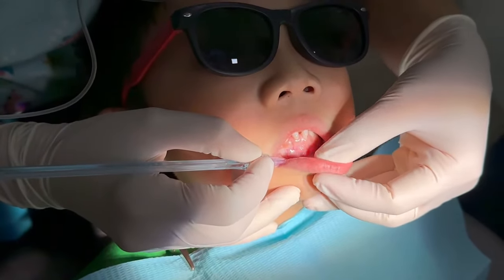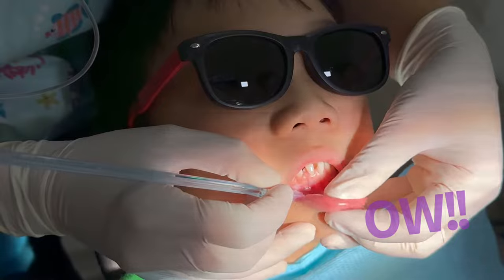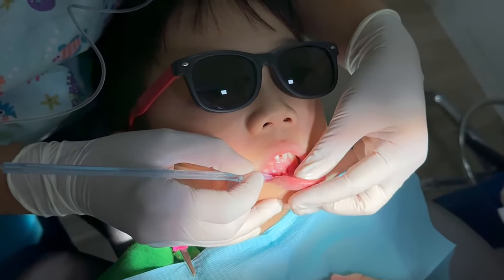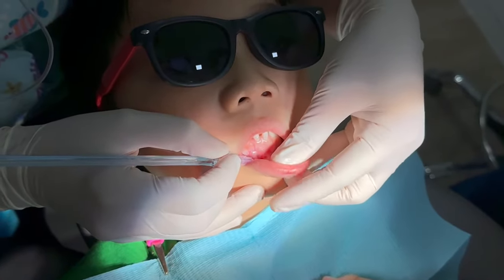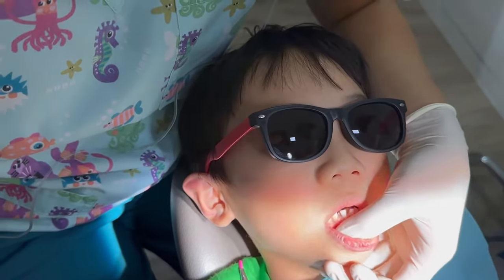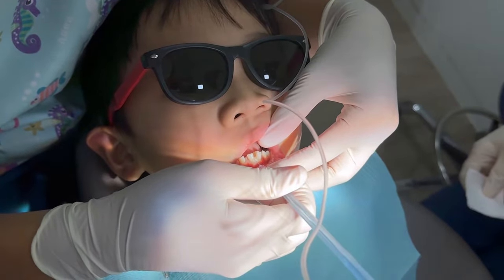Which is your favourite Pokemon? Who's your favourite Pokemon? I'm going to pull your lip up — I see a balloon already. There's a small balloon growing over there. Do you feel the balloon? It will help make your baby tooth shaky so that it will drop off. I don't like the injection. But you're already doing it — just one more, okay? You're doing a great job. I don't feel anything. That's what I'm supposed to do — I want it numb. Have you felt numbness before? It's quite a funny feeling. Sometimes it feels like you have a balloon in your mouth or like you have a lot of marshmallows in your mouth. The slower I do it, the less you will feel — it's like blowing a balloon slowly. It feels so weird.